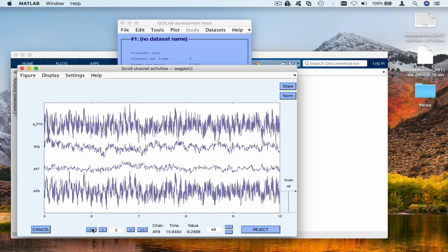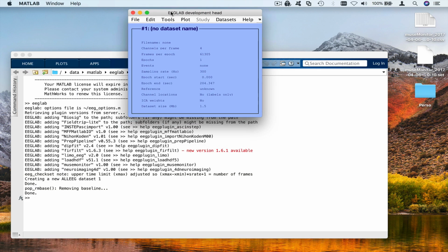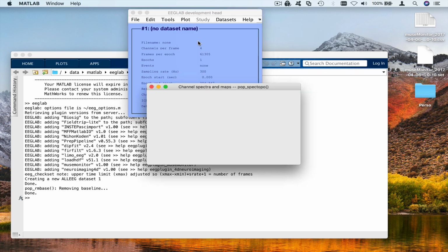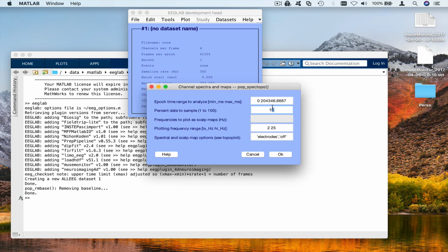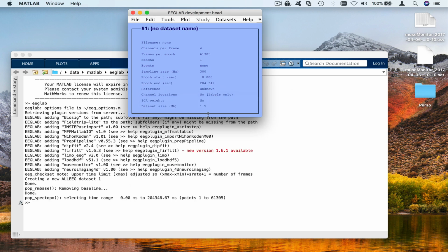So to try to remove that noise, we'll use ICA. If we were to just look at the quality of the channels, we would go to channel spectra and map. So plot, channel spectra and map. Then we put 100% of the data instead of 15%, 1 to 150, because it goes up to 300 hertz. So we want to take half of the maximum frequency.